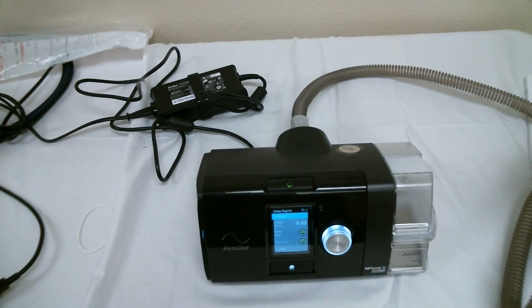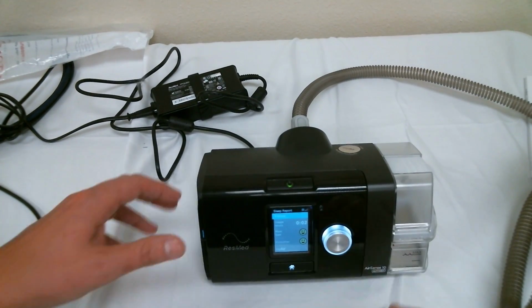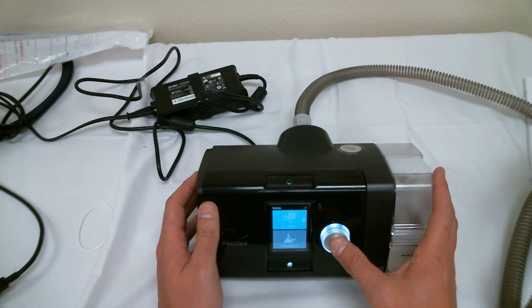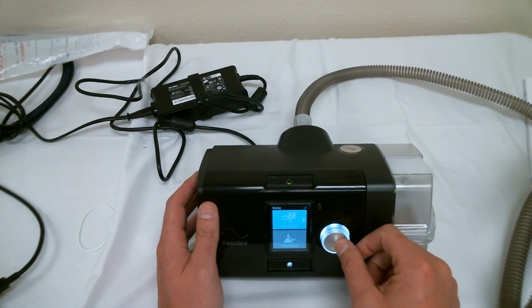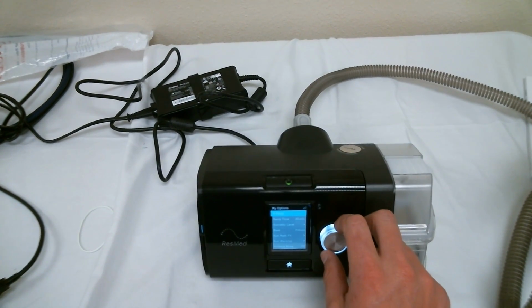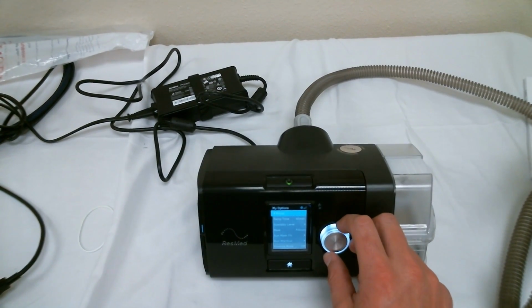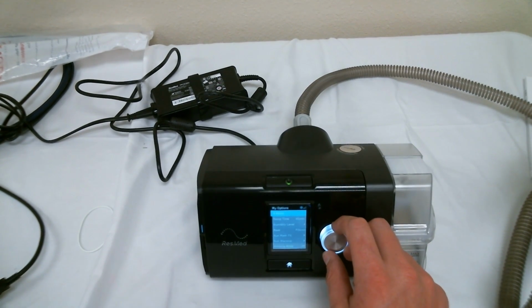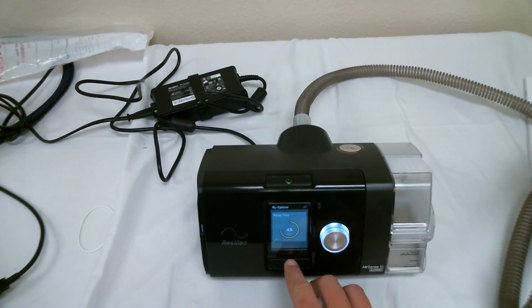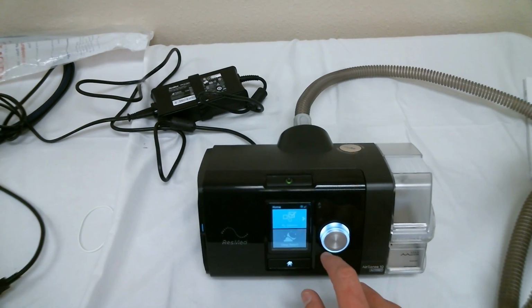Finally, let's go over your menu options in the patient menu. To access that menu, scroll to highlight the My Options tab and press to enter it. Once in the Options menu, you can scroll by twisting the knob and access or confirm changes by pressing the knob. If you're ever lost or don't know how to get back, you can press the home button at any time and it will take you back to your main menu.